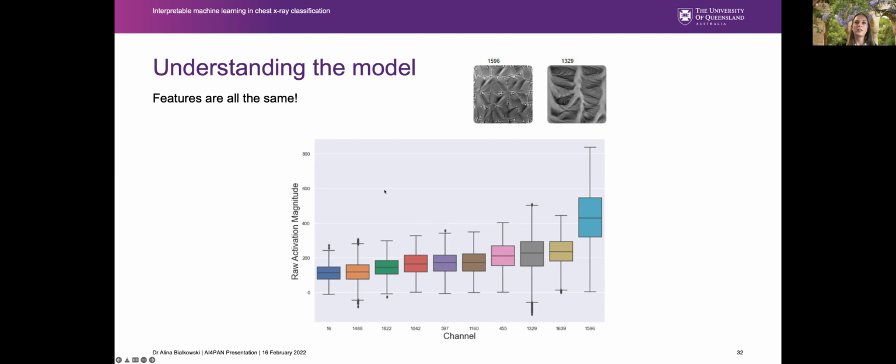And if you actually look at the distribution of these across the different classes, it turns out it doesn't actually vary very much. So basically what it's telling us is that the neural network models are always looking at the same features. So basically looking at, is it lungs? Is it perhaps that kind of white fuzzy appearance? But that's not really that useful when we want to analyze the properties of a disease.